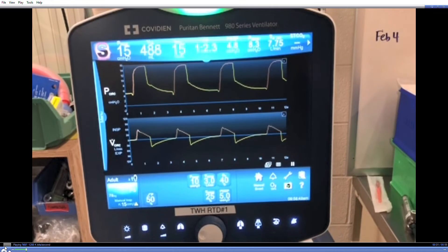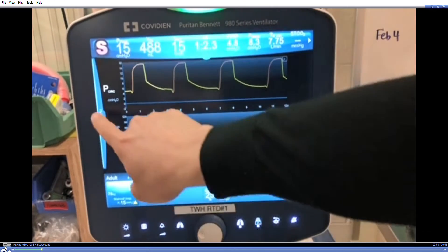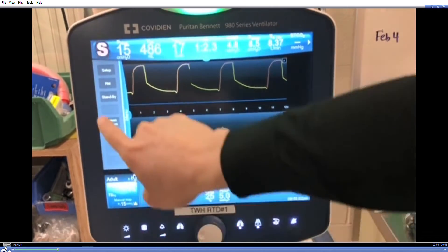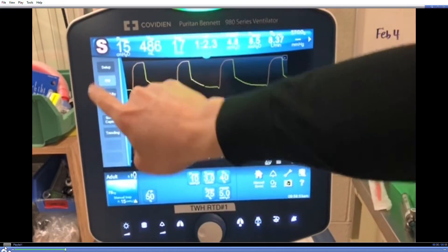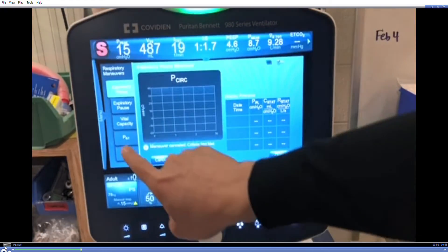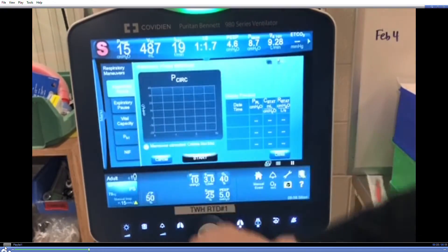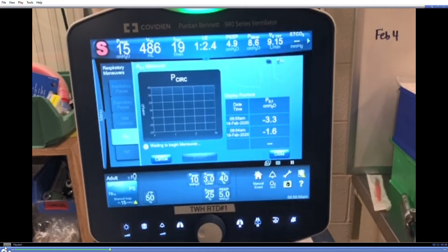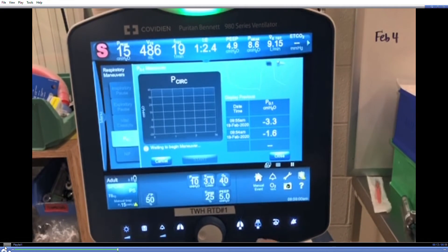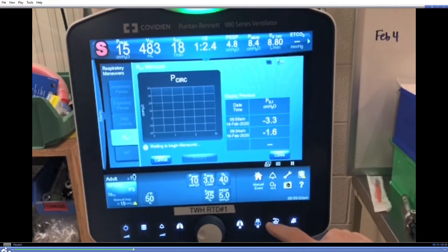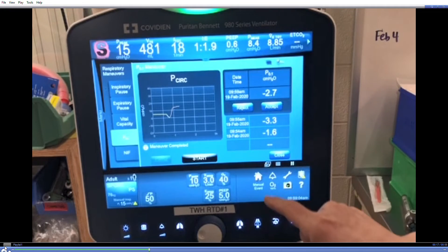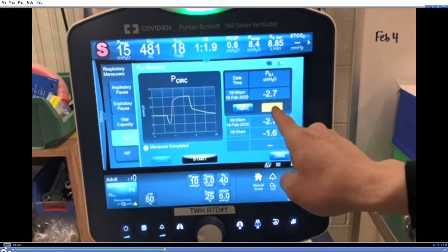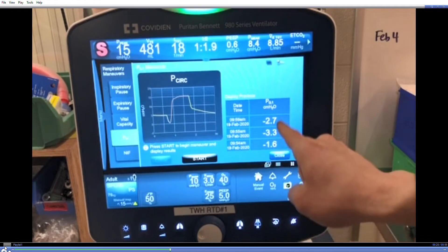To begin respiratory effort monitoring on the PB980, open the menu on the left, select the respiratory maneuvers button, then select P0.1 and press start to wait for the ventilator to perform the maneuver. You may choose to accept or reject the value to add to the trend list, depending on any interference like patient coughing or turning.